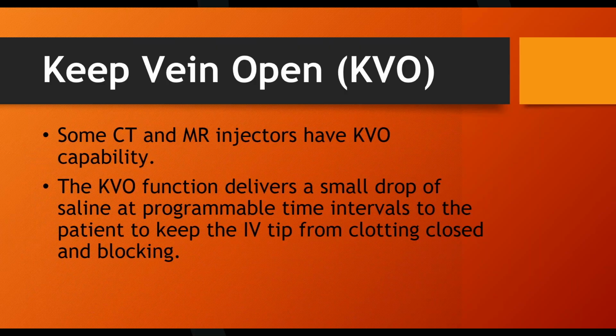Not every injector system has KVO, but a lot of them do. KVO gets set up in the setup menus, and this can be set up a whole different bunch of ways, but anywhere from every 10 to 60 seconds, we're just going to inject 1 milliliter of fluid, just enough to keep the tip of that IV needle from clotting. All right.